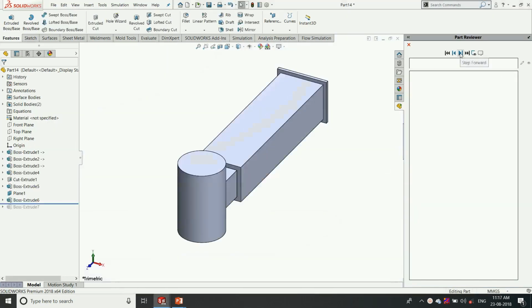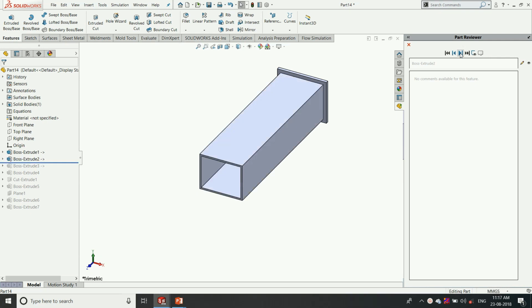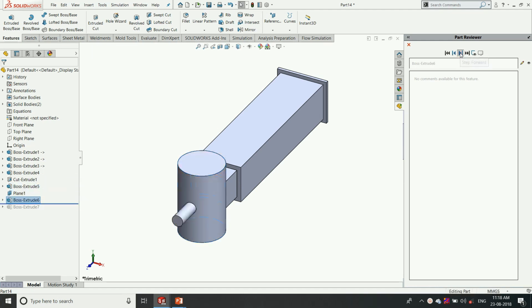In this model, we are going to see how this component is made in a very simple procedure. From a simple 2D sketch, as we saw before, we can draw a telescopic arm of the X-ray machine with a simple 2D sketch option, then extrude it with the basic specifications. So this is the entire 3D model, which was drawn with the simple 2D sketch and extruding it into a 3D model.